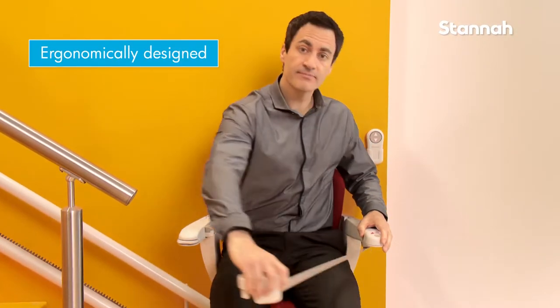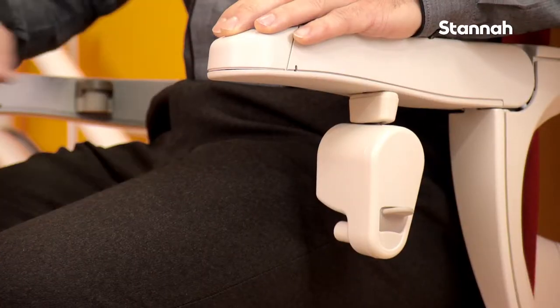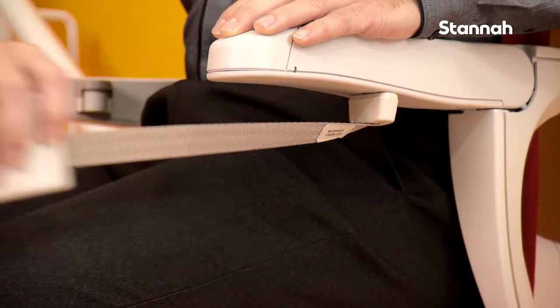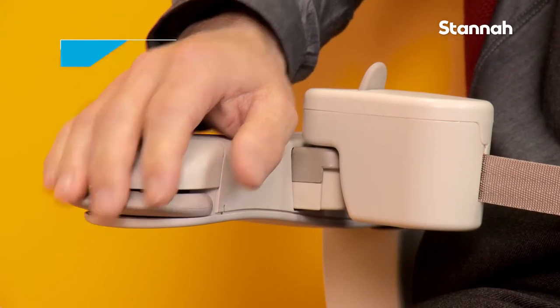For your safety, Stana's ergonomically designed standard seatbelt can be operated simply using one hand. It is positioned in front of you just underneath the armrest and is fastened and released with the click of a button.